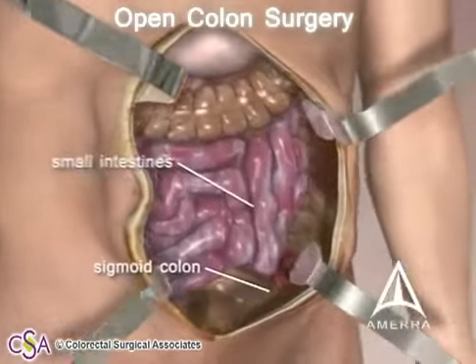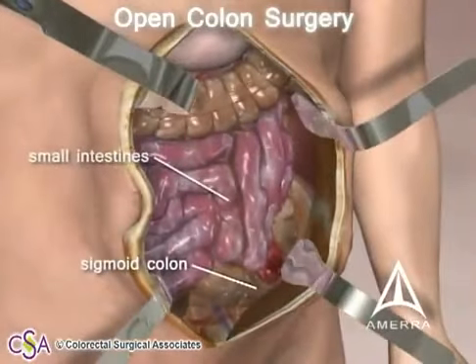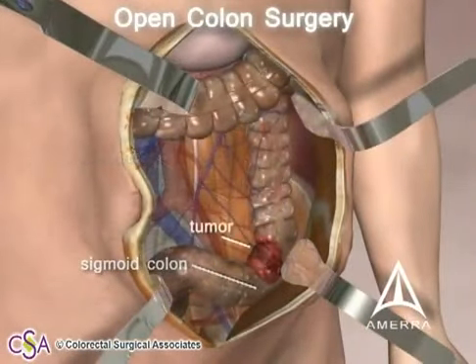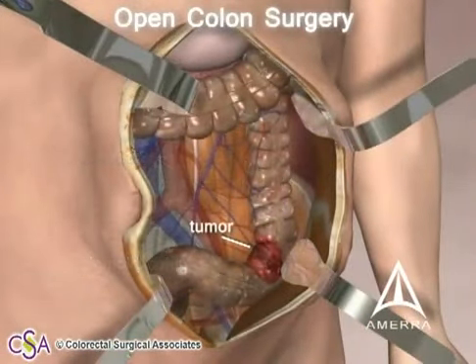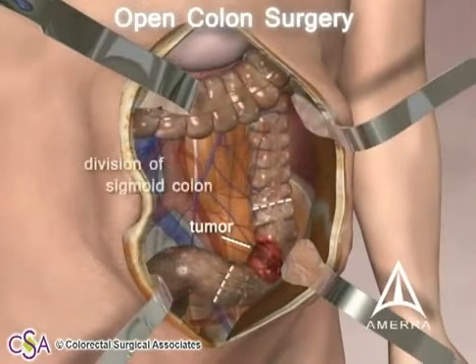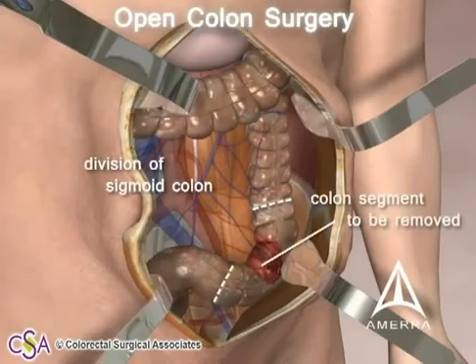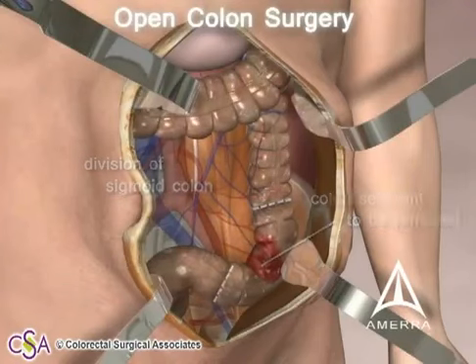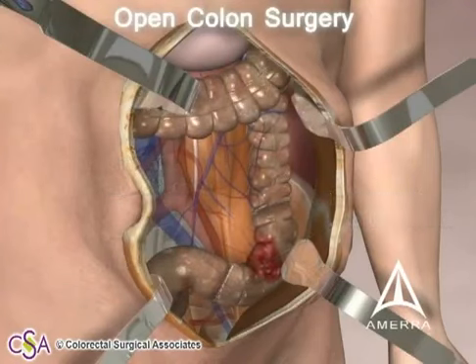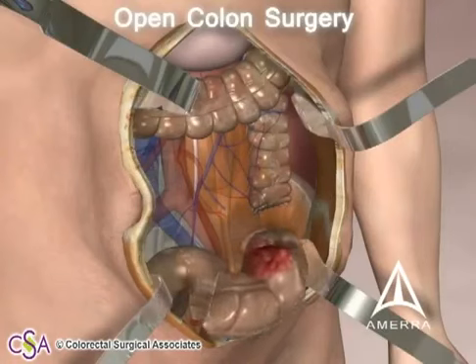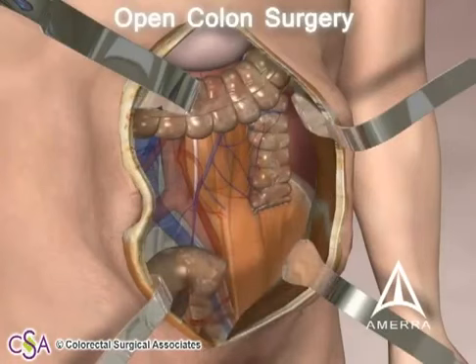In this case, a colon mass of the sigmoid colon is identified and isolated for removal. Once divided, the specimen is removed from the abdominal cavity.